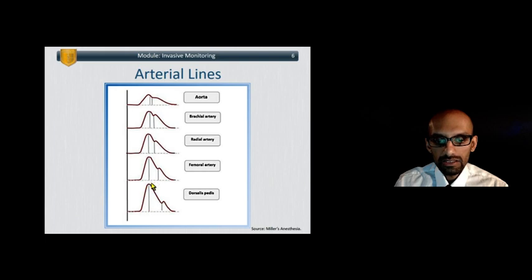You get a systolic overshoot as a result of that. Okay, and so the aortic waveform actually gives you the most faithful portrayal of what a natural arterial waveform should look like, in the absence of a whole lot of resonance, because obviously the aorta hasn't branched off yet.